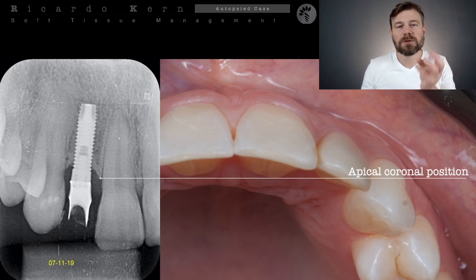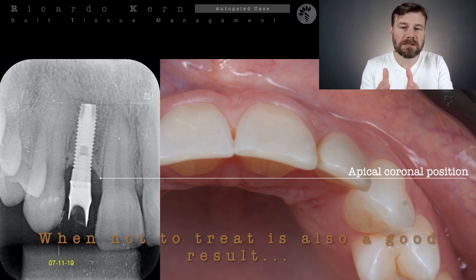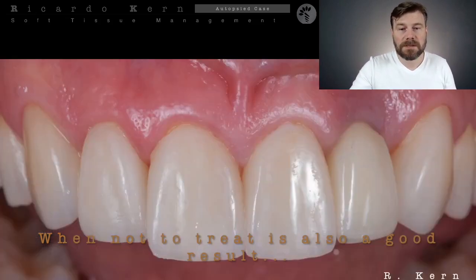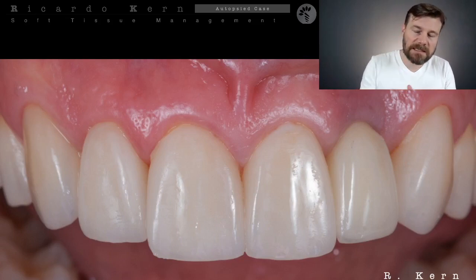Okay, that is good for us to understand, because I don't like that you apply surgery in a case where you're going to lose the game. So we need to choose exactly which case we can apply the right approach to really be successful in this recovering. And okay, we're going to choose a clinical case, and you're going to treat a more common problem and an easy one for this starting point.